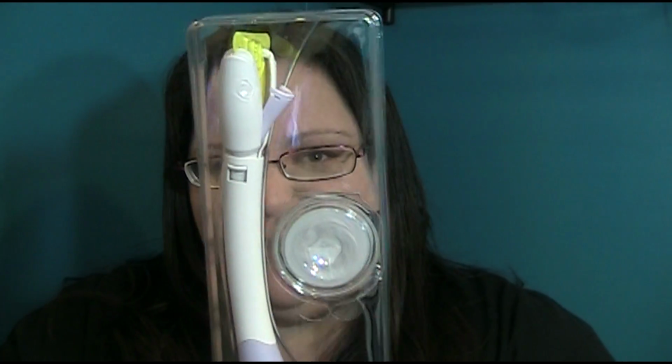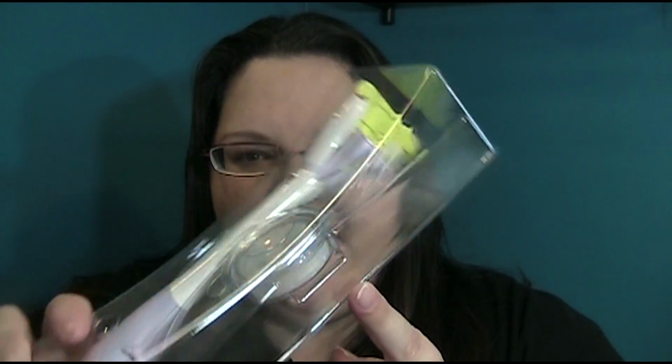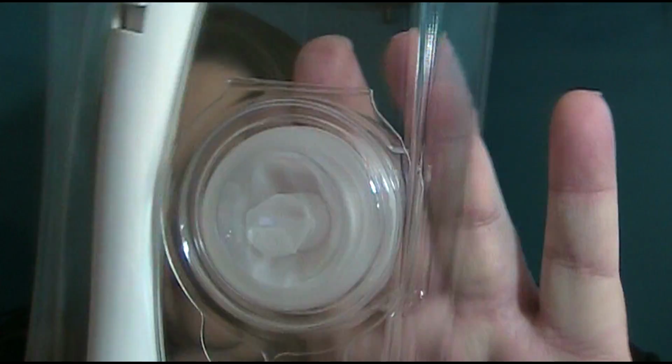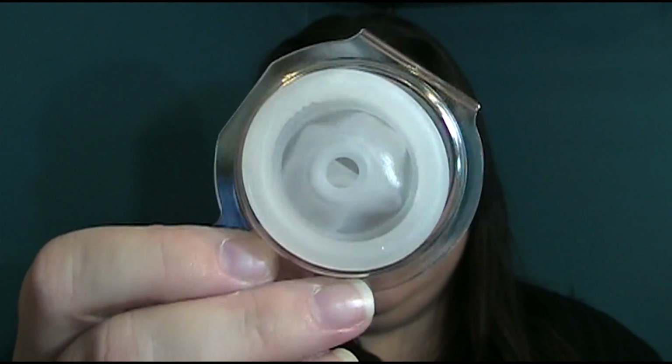It comes with this plunger and a conceptacle is what they call this. This is a combination of a, let's see, I don't know if it'll focus in real well. It is a condom with a cervical cap inside of it. And it is all latex free, so this can be used by someone even if you have a latex allergy. So what you do is you can open this up, and the condom with the cervical cap is in here, and you roll it on as you would a standard condom, and you can have sex as you would normally have.